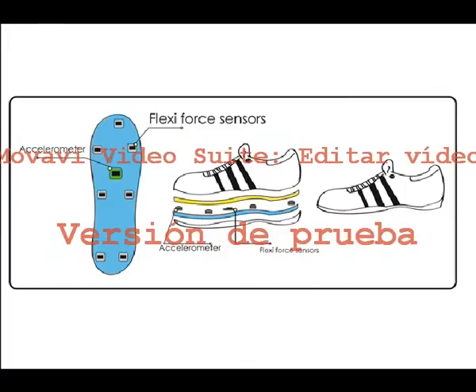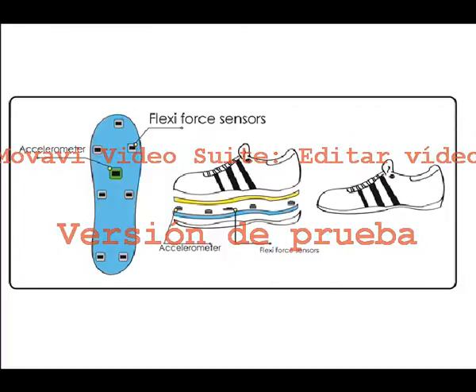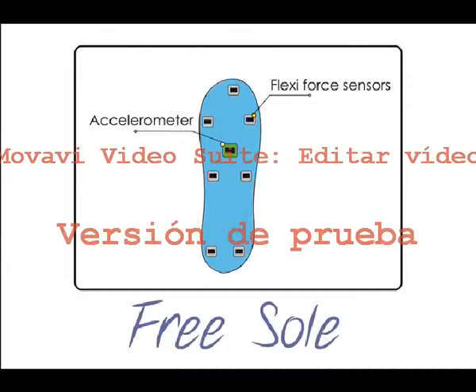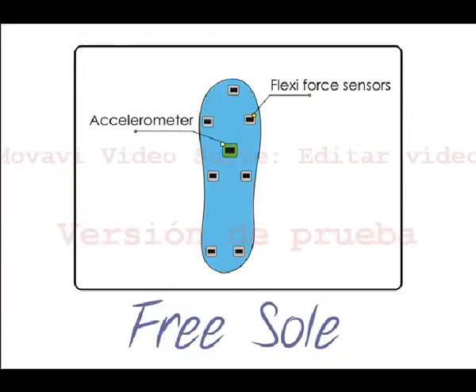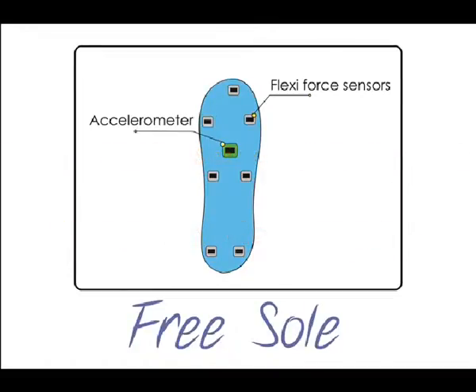We designed a device that allows recovery patients from knee injuries to do the bike exercise section of the recovery and strengthening process remotely in the outdoors. FreeSole is a sole that can be coupled to any sport shoe, therefore it's wearable. The FreeSole has 7 small FlexiForce sensors displayed in specific spots of the sole to measure the area of the foot which is under stress.